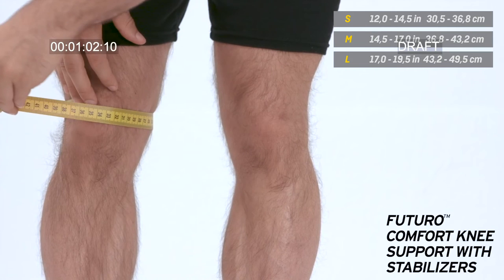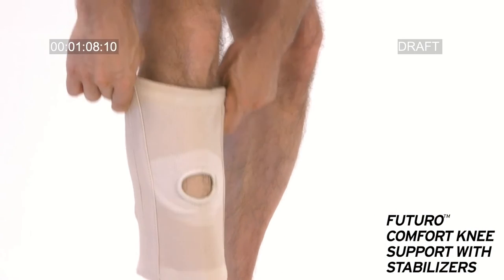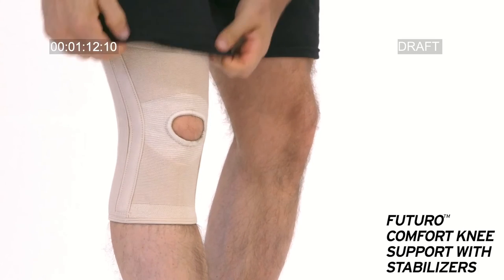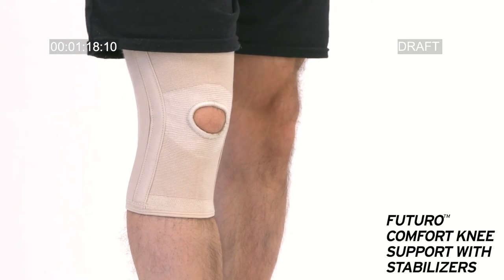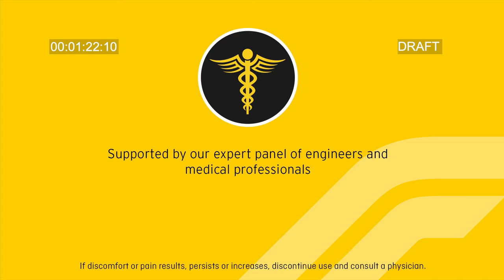Fits left or right knee. Measure around kneecap while standing. Slide the support over foot, pull support up onto knee, and ensure that the center patella locator is placed on the kneecap.